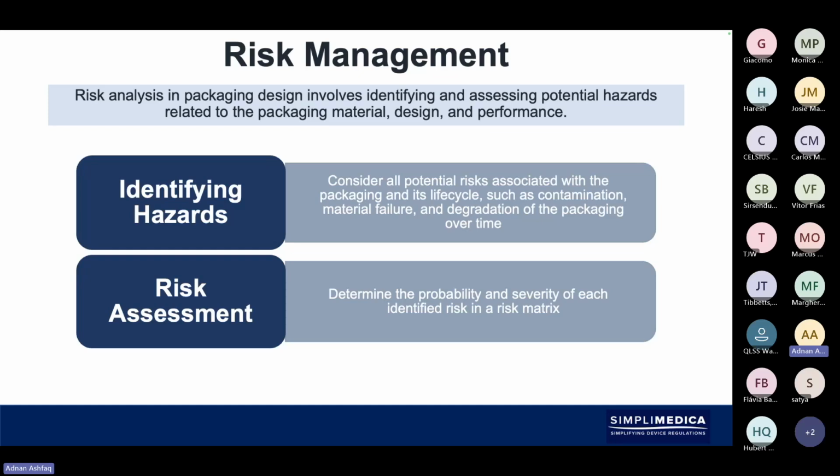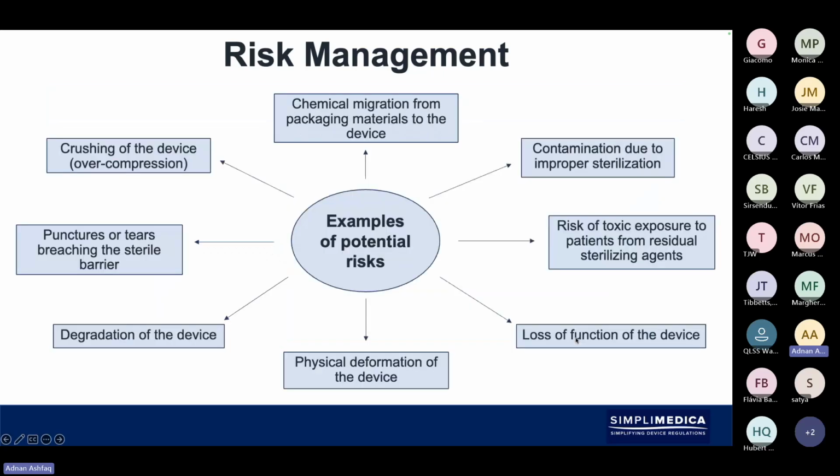And that's why aging and shelf life trials are so important as well, and making sure that you have a stability chamber which is calibrated and integral, that you can put the device with the packaging in and test it over a period of time. There are a few slides coming up just about stability as well. So as I said, with risk management, identify and do your risk analysis.